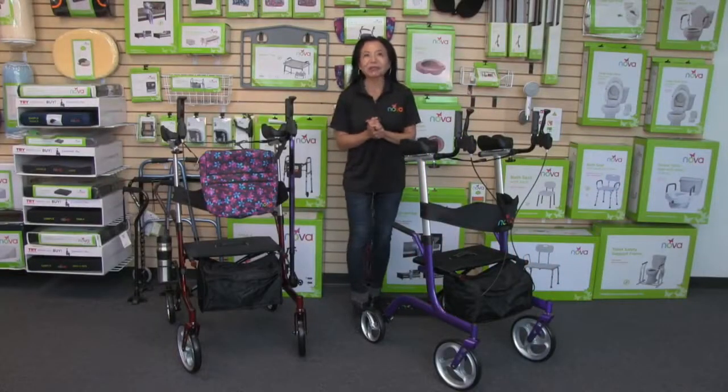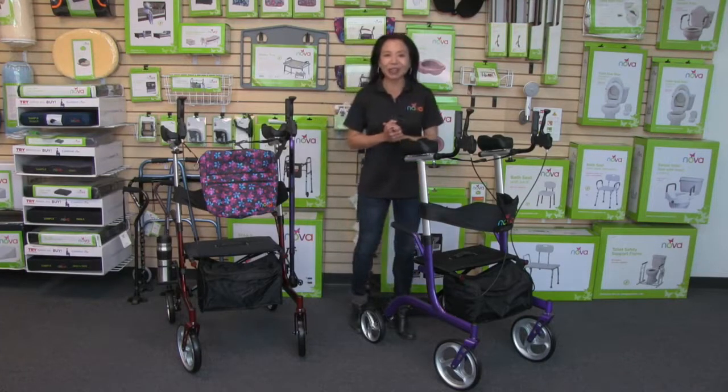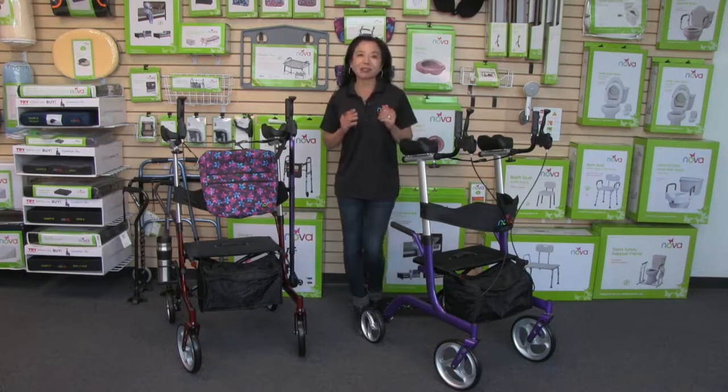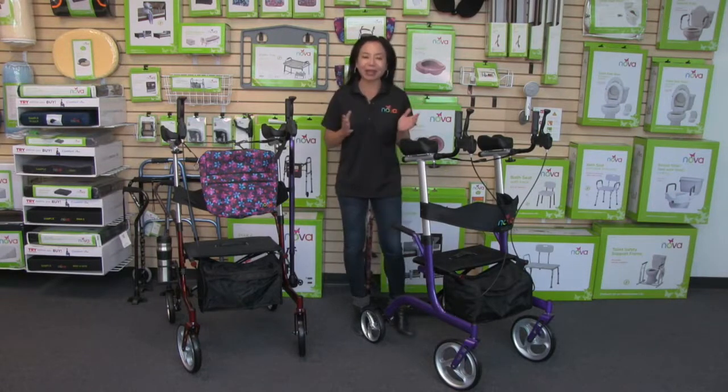Hi, I'm Sue, the founder of NOVA, and I am so excited to introduce the Phoenix Rise Up Rollator. We have been in the walker business for 27 years, providing you with the most trusted and diverse line of walkers on the planet.